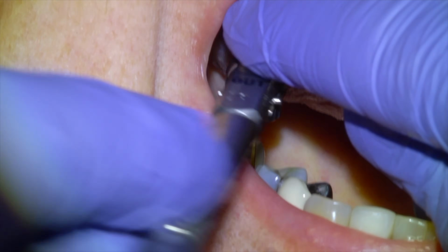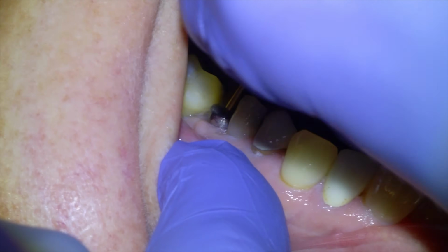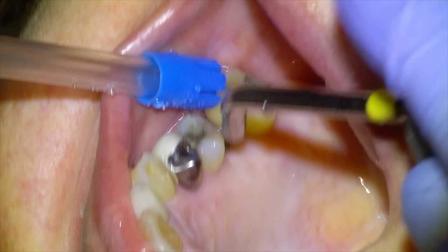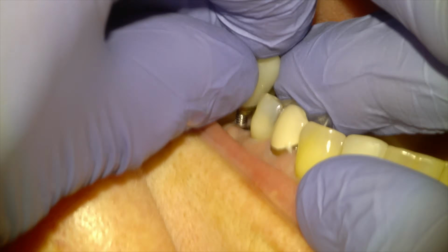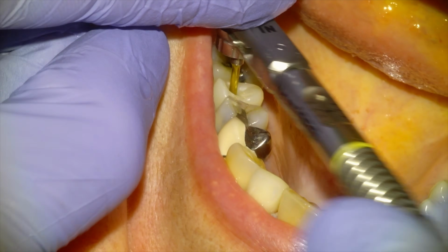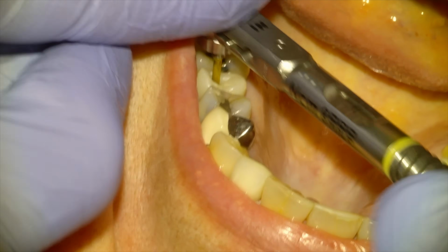So we'll take off the healing cap with the torque wrench, remove the healing cap. The tissue looks nice and healthy. You can see how much the 2.7 has drifted in just a very short period of time. But we'll put in the implant crown, happy with the fit. Octagonal platform, I love tissue level.